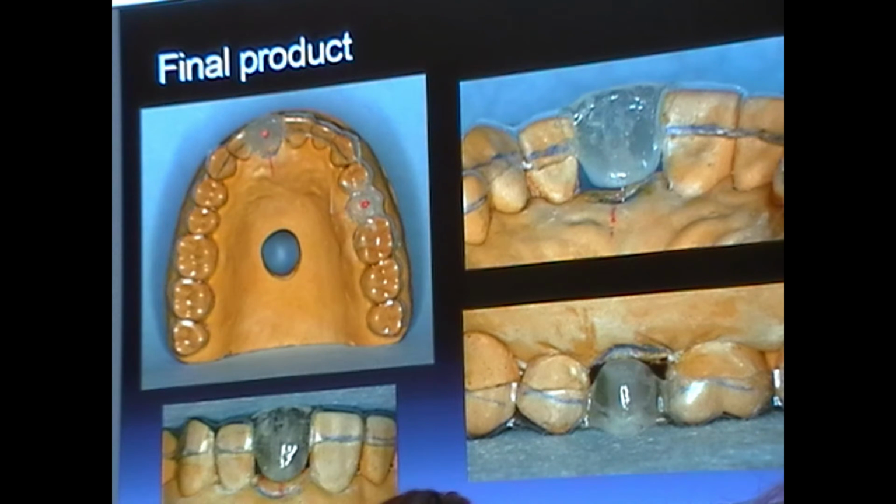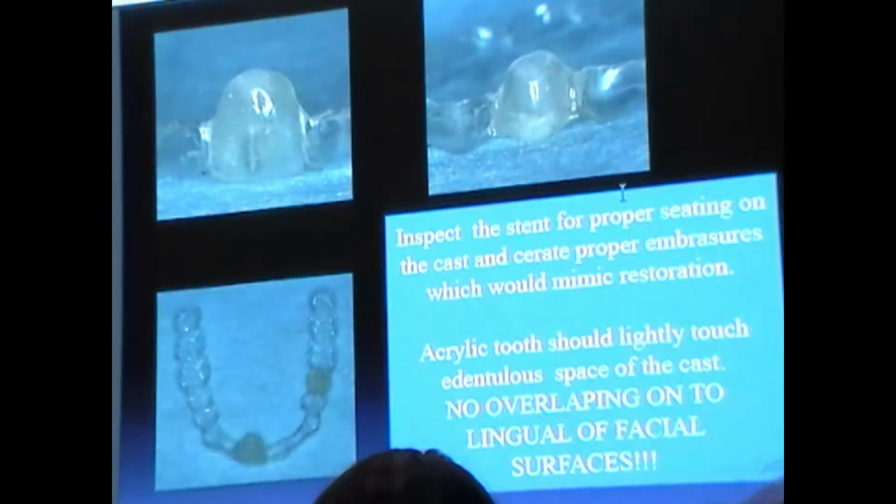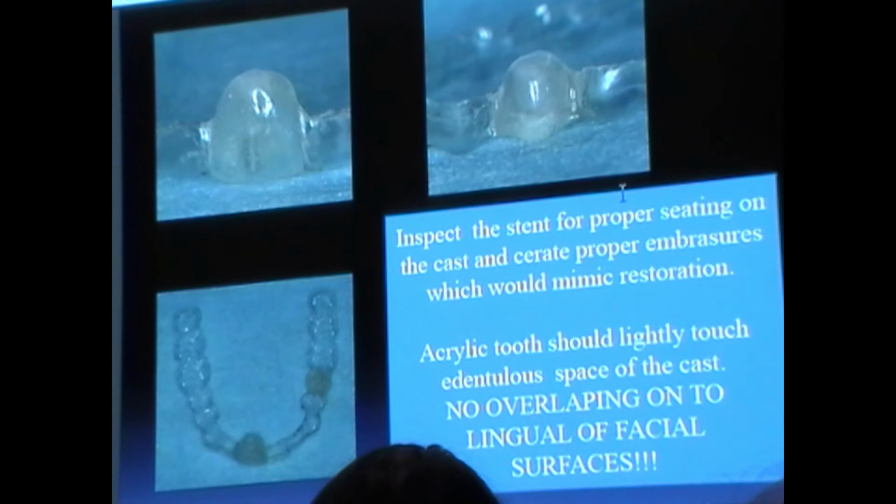Please don't worry if you have voids within the material. It's a small space, there's only so much you can do with that. You want to make sure that the stent is easy to remove and place. If it's not, 9 times out of 10, the surgeon's not going to use it.